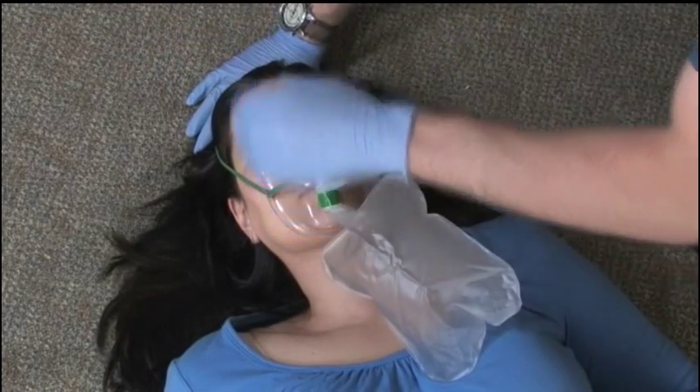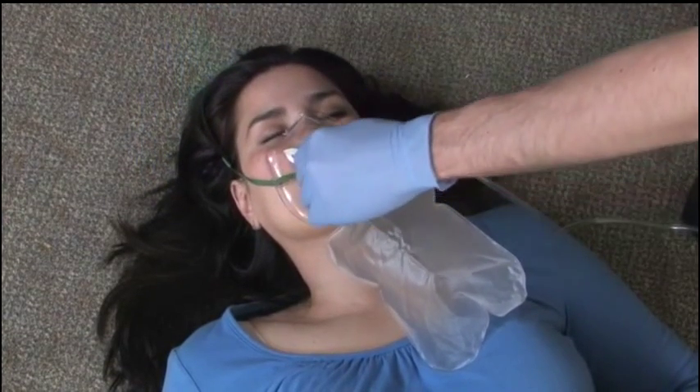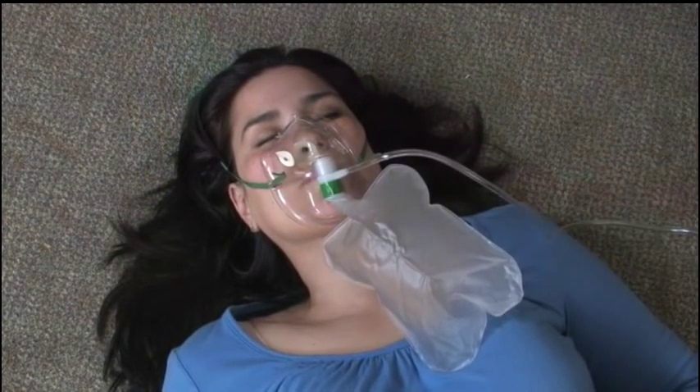The liter flow for a non-rebreather should be between 12 and 15 liters per minute. It should not be allowed to go below 12 liters. A non-rebreather mask will provide concentrations of oxygen ranging from 80 to 100% depending on liter flow.